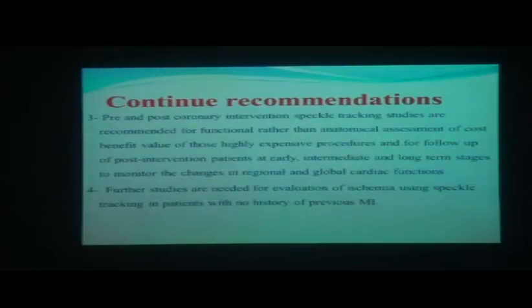Pre- and post-coronary intervention speckle tracking studies are recommended for functional rather than anatomical assessment of cost-benefit value of those highly expensive procedures and for follow-up of those patients in post-intervention states in the short, intermediate, and long-term phases. Further studies are needed for evaluation of ischemic segments using speckle tracking in patients with no history of previous myocardial infarction.